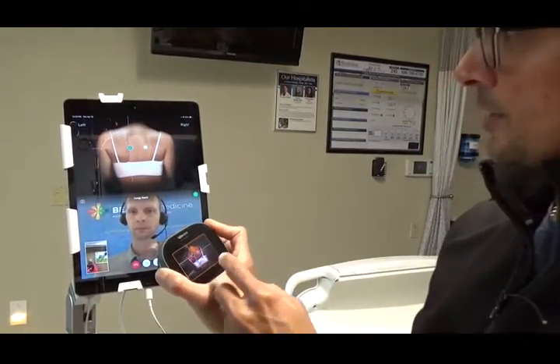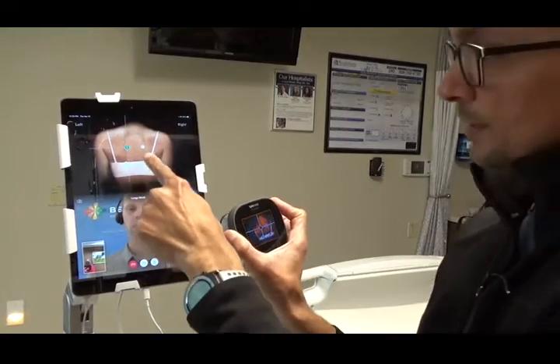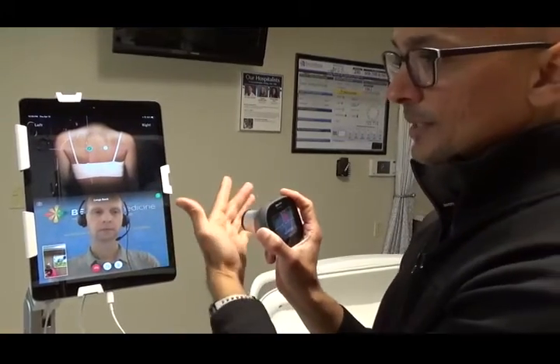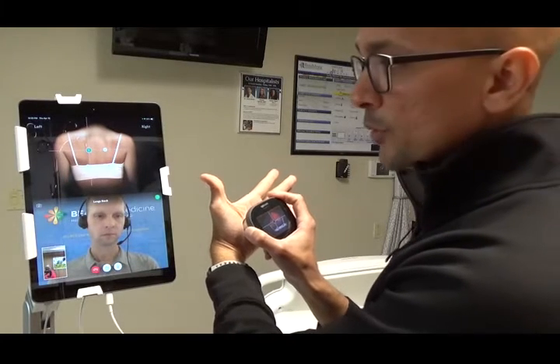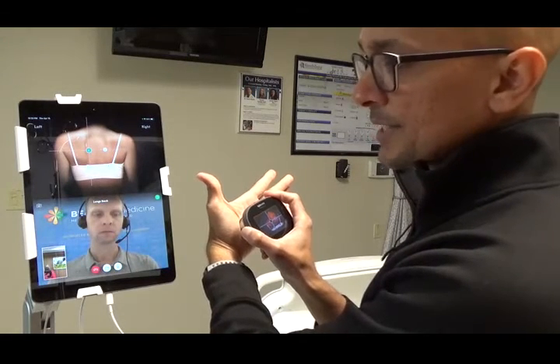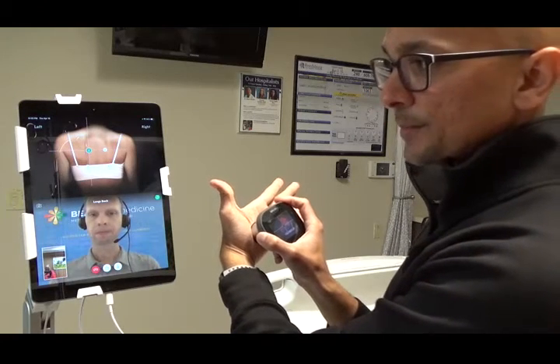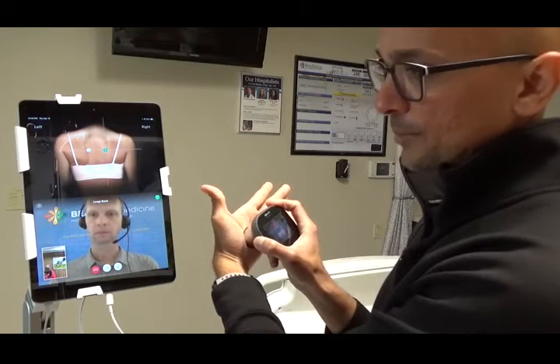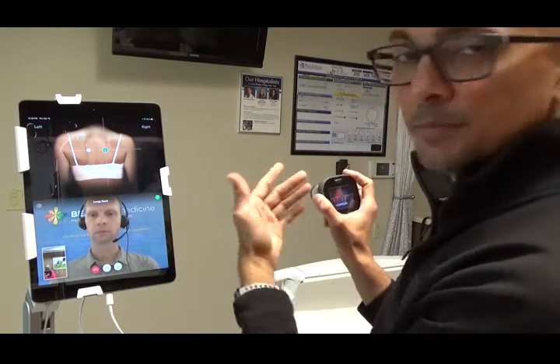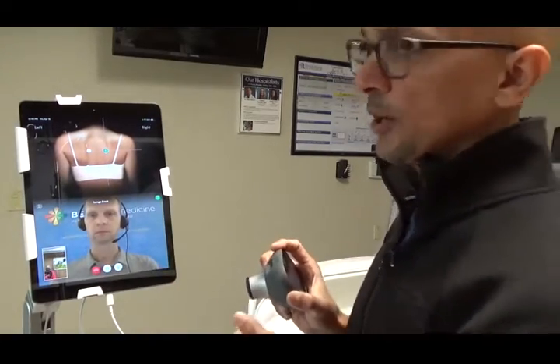Alright, so this is the front auscultation. Now we're at the back auscultation, same thing, where Dr. Scholes wants us to auscultate. Like I said, go directly to the skin, and then as the physician moves the number, the staff member goes to the other number, and that's how you follow the physical exam side of things, right? So you do all four, for example, move around, and that's your lung exam. So we'll go ahead and move to the heart now.